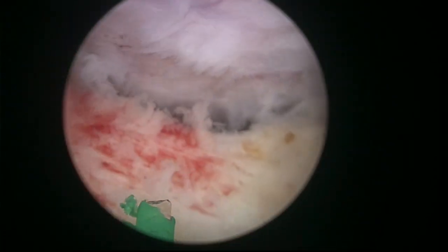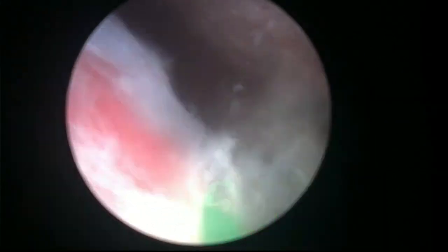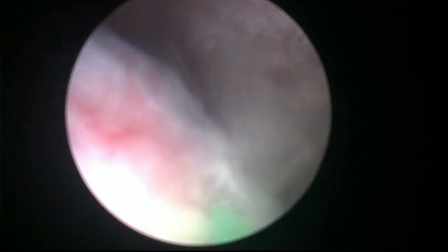It's important to coagulate the vessels at the level of the bladder neck. Sometimes it's where bleeding can happen. Sometimes with the water inflow, they look towards the bladder and you don't see them very well, so you have to get to the edge. You see, like this, to spot them. It's usually minimal bleeding, but it could compromise the morcellation. So there we are.